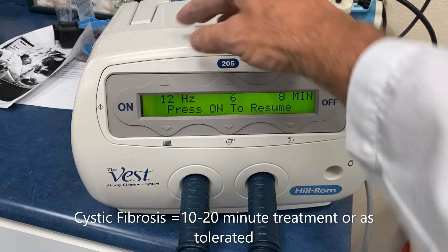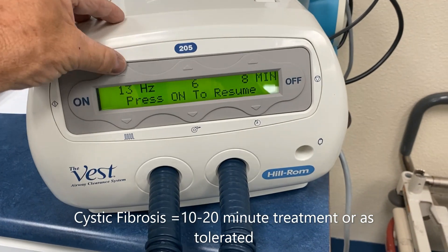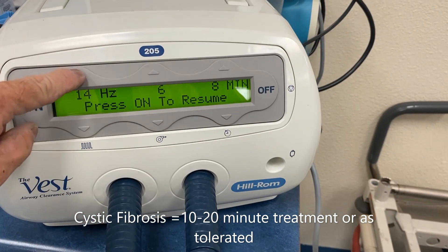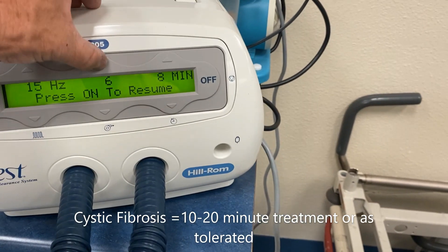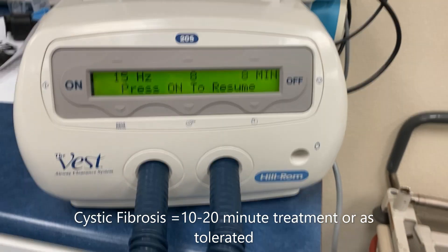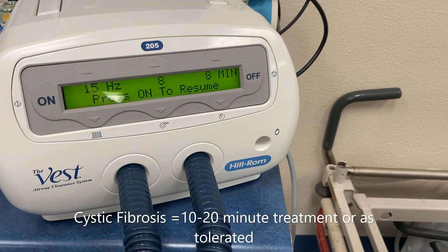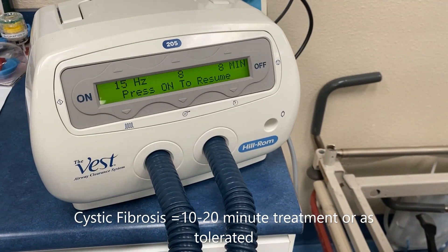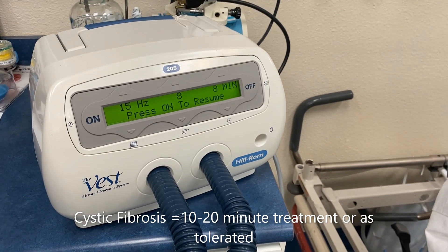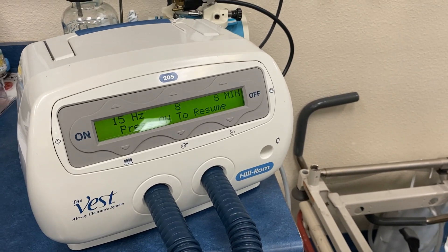We can increase the frequency by pushing the up and down arrow to get a higher vibration effect. We can increase the intensity here as well, and the time can be changed too — pretty flexible. You want to dial in what the physician ordered. If the physician is allowing you to make the settings, I would always ask the patient if they've used this at home before and what kinds of settings they've used to keep their home regimen going.